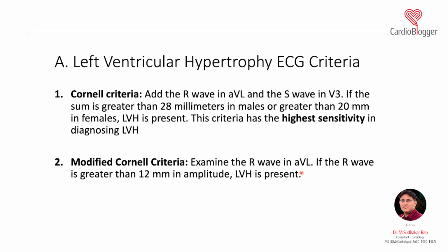Similarly, when LVH is there in ECG, it means obviously LVH will be there on echo. It means the patient has left ventricular hypertrophy and end organ damage has started occurring. Similarly, other diseases like the aortic stenosis, which causes the left ventricular hypertrophy. When the aortic stenosis causes left ventricular hypertrophy, it means the disease has progressed to that level that patient will now need the surgical intervention like aortic valve replacement.